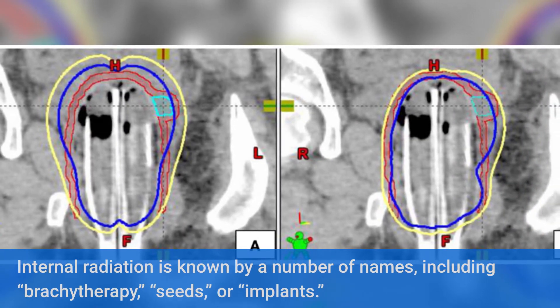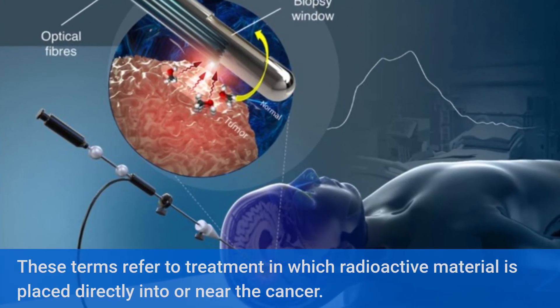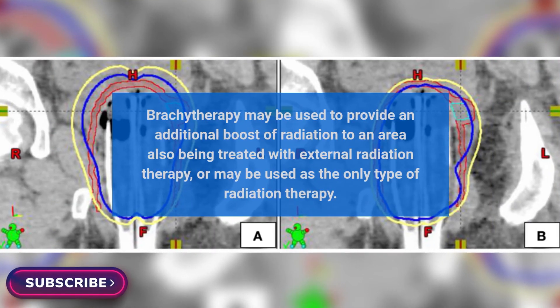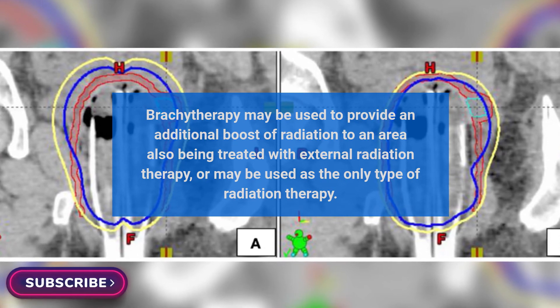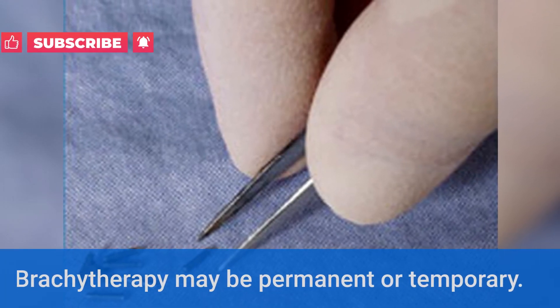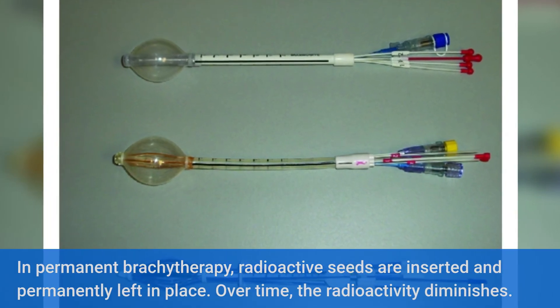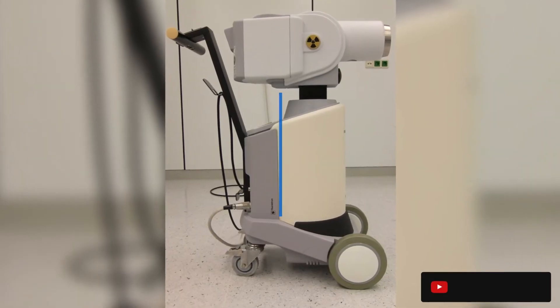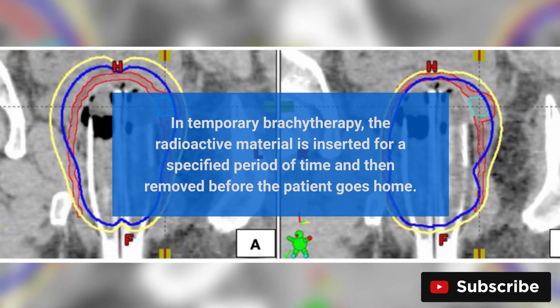The second method of radiation therapy delivery is internal radiation therapy, or brachytherapy. Internal radiation is known by a number of names, including brachytherapy, seeds, or implants. These terms refer to treatment in which radioactive material is placed directly into or near the cancer. Brachytherapy may be used to provide an additional boost of radiation to an area also being treated with external radiation therapy, or may be used as the only type. Brachytherapy may be permanent or temporary. In permanent brachytherapy, radioactive seeds are inserted and permanently left in place — over time, the radioactivity diminishes. In temporary brachytherapy, the radioactive material is inserted for a specified period of time and then removed before the patient goes home.